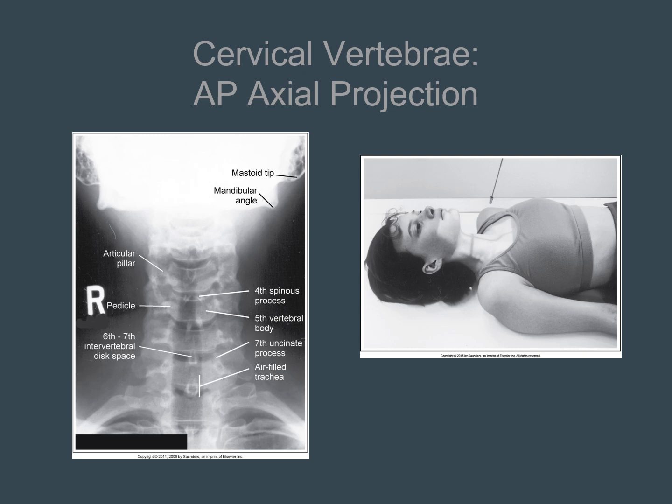The long axis of the cervical column is aligned with the long axis of the exposure field. The fourth cervical vertebra should be demonstrated at the center of the exposure field, and an area from the superior portion of the C3 to T2 and the surrounding soft tissue should all be included within the exposure field.